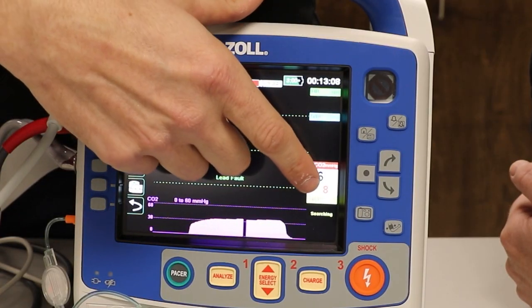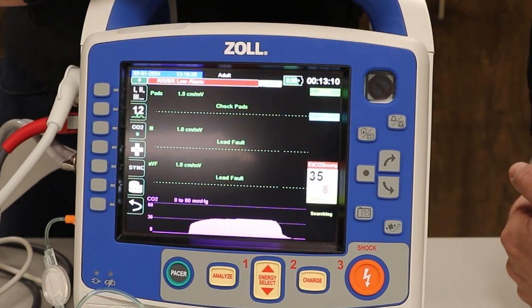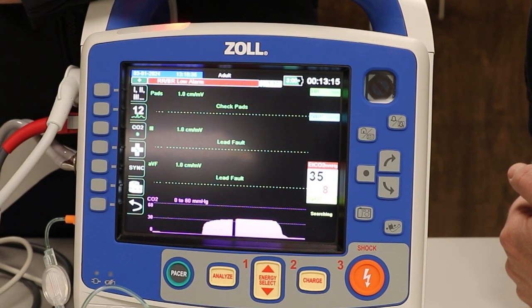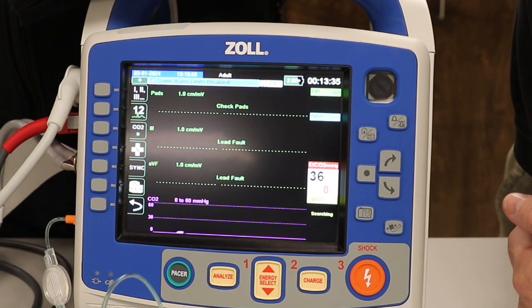If you look below that, the 8, that's the actual respiratory rate. The red 8, that's what you're seeing. And if you look below that, the very, very bottom, that's your actual waveform. Now I'm going to do this simultaneously so you see the numbers.